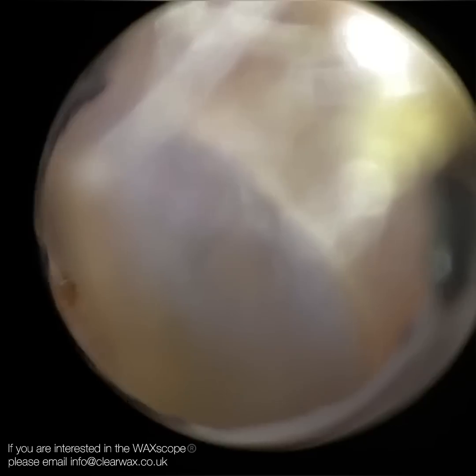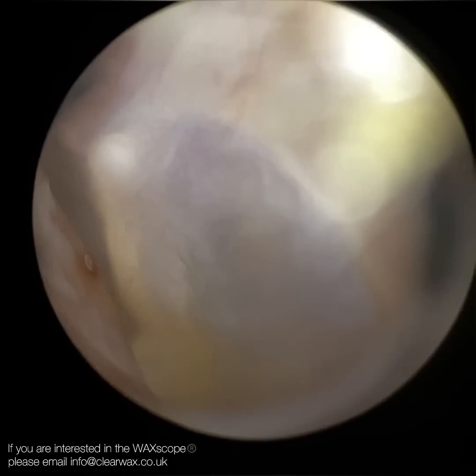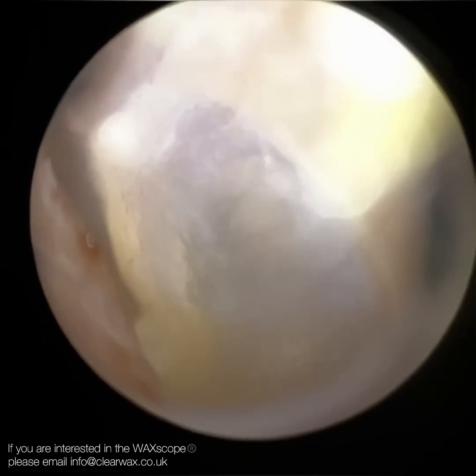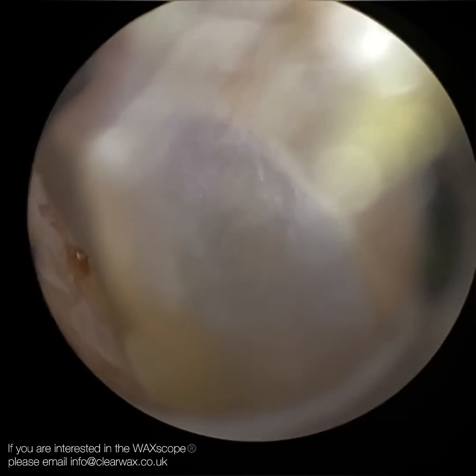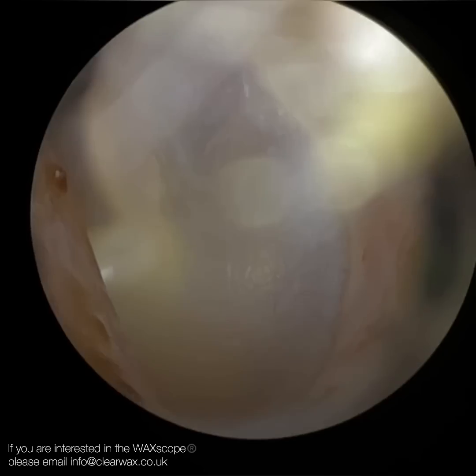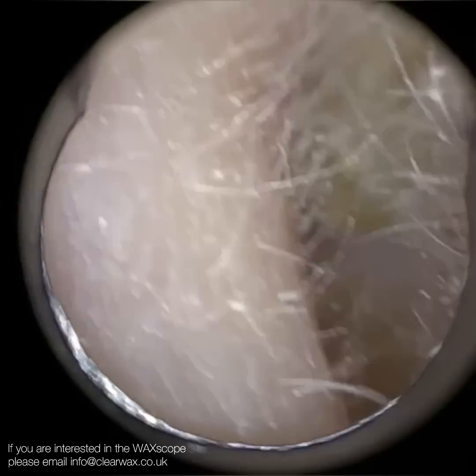Now here you'll get a perspective of how narrow and bendy the patient's ear canal is. We're going to stretch the ear now. I'm brightening it slightly to get a better view of the eardrum, but the anterior canal wall — you can see it on screen at nine o'clock — is protruding on the bony part of the ear canal, making the ear canal very, very bendy.